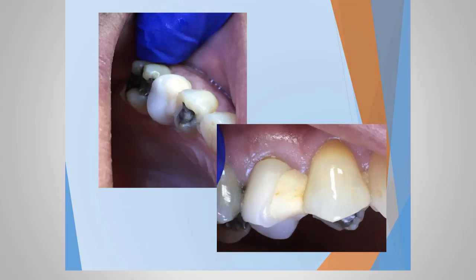Here we are with, again, tooth number 4, which has an existing crown that was repaired, but the repair is not going well, and we want to just make a new crown for this tooth. So the first thing that I did was, because the patient didn't like the way this crown was repaired and didn't like the shape of it, I wasn't going to take an impression as is.